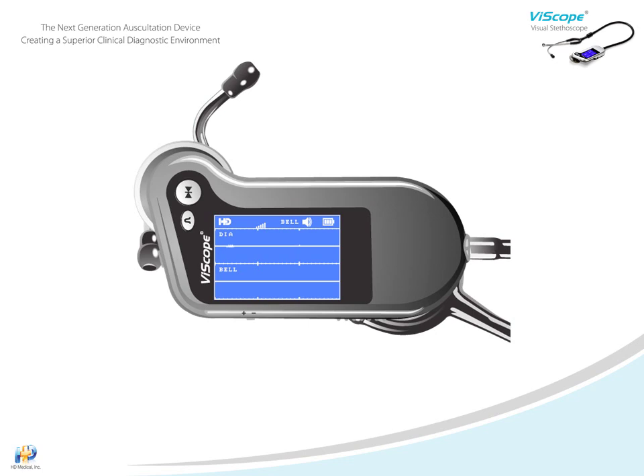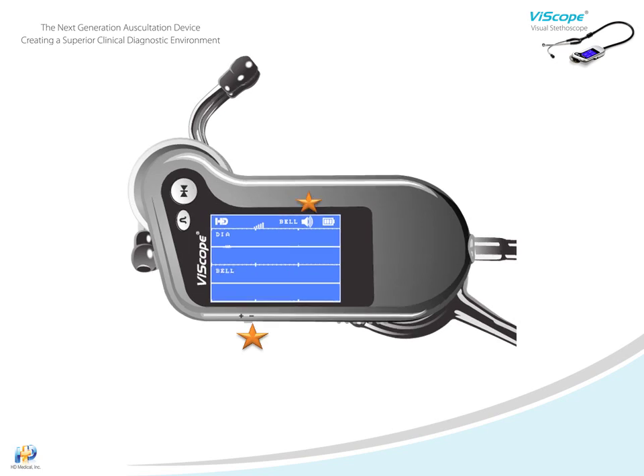The Viascope's high-definition sound adjustability is very useful in multiple situations. The volume is adjusted by pressing the three-way key. When you press the key, you will make changes to the volume level and the volume icon will change — medium to loud, loud to low, and low to medium.